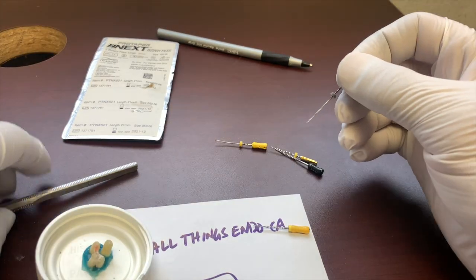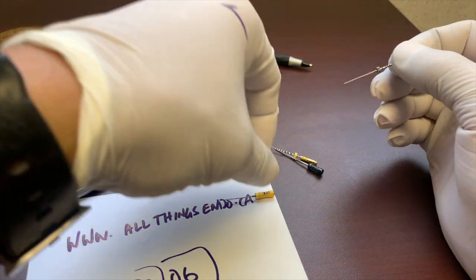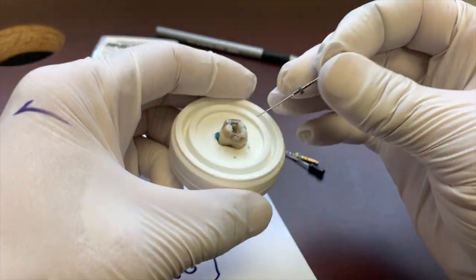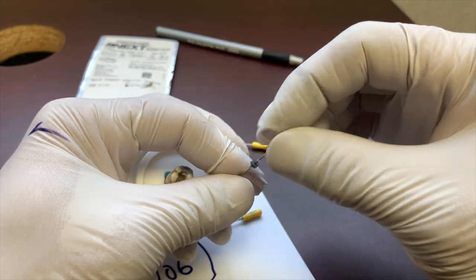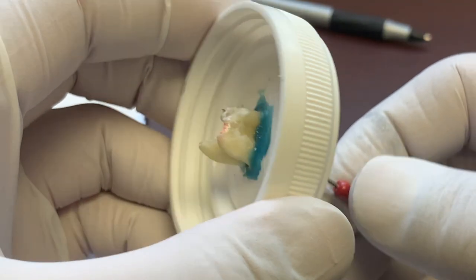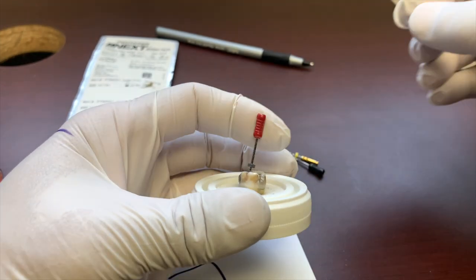All right, so let's go ahead and get our working length. We've got our 55 K file. Typically, they don't really make nickel titanium hand files over a 50. So when we hit the 55 mark, you're gonna need a 55, 60, 70, 80 if you're gonna be doing cases like this. You gotta have them floating around, you can't wing it. So let's get our working length. You can see where that 55 just slides right through. So we get our working length with our apex locator using a large hand file like this.